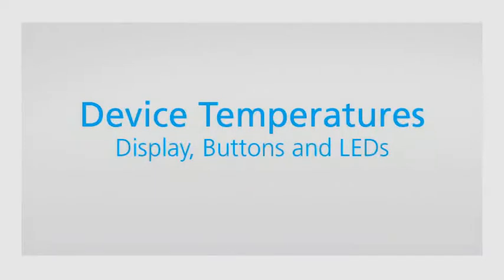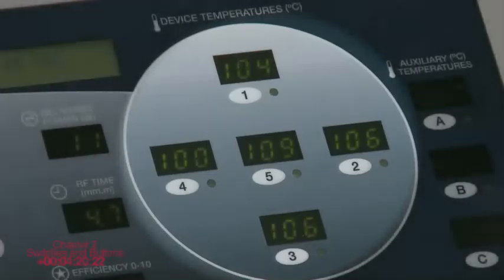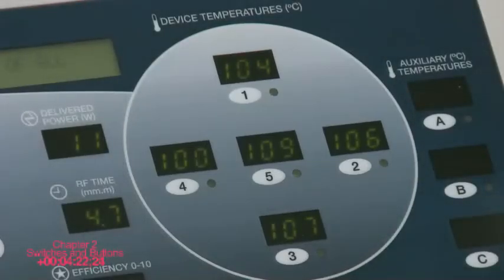Device temperatures, degrees centigrade display. Displays the temperature readings of the device thermocouples in whole units of degrees centigrade. For temperatures out of range, the display will either read low or high. Also, if using a device with fewer than 5 thermocouples, the locations with no thermocouples will display OP. If the device is not connected, the temperature displays remain blank.